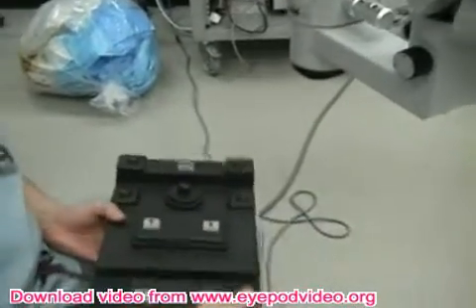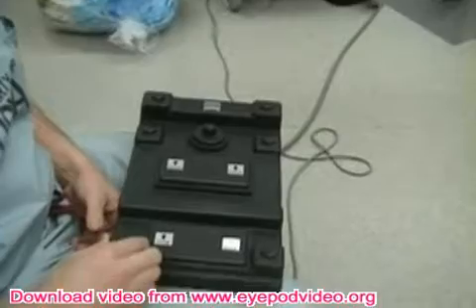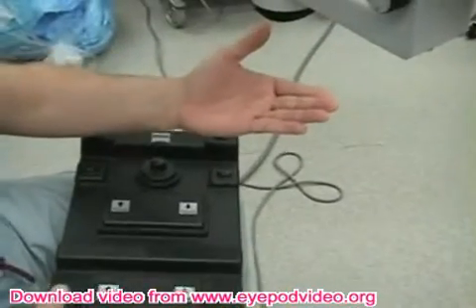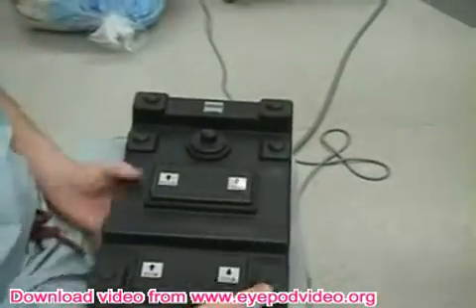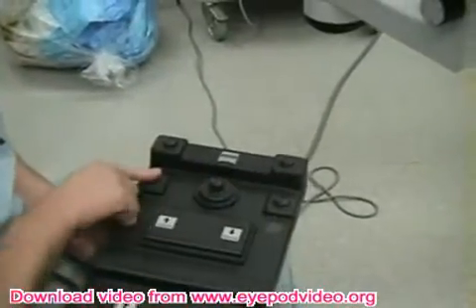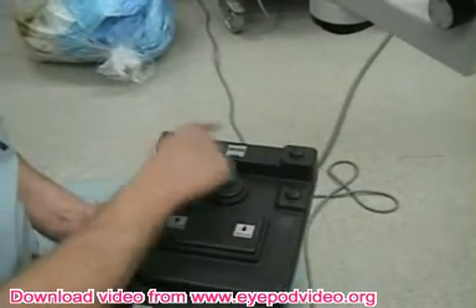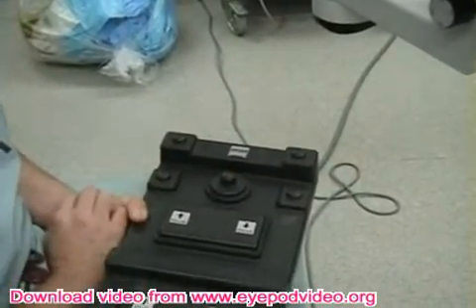There are other switches on this device. There's one that makes the light go on and off — there are two lights, though it's not working right now. These are lights on and lights off. These additional switches are not used at the VA, but at the university they do additional functions: this makes the light brighter, and this makes the light dimmer.